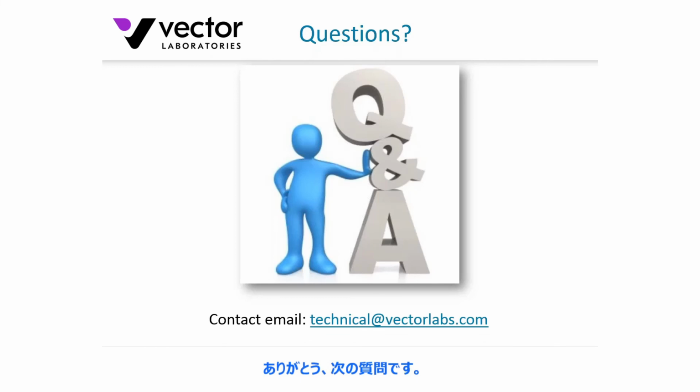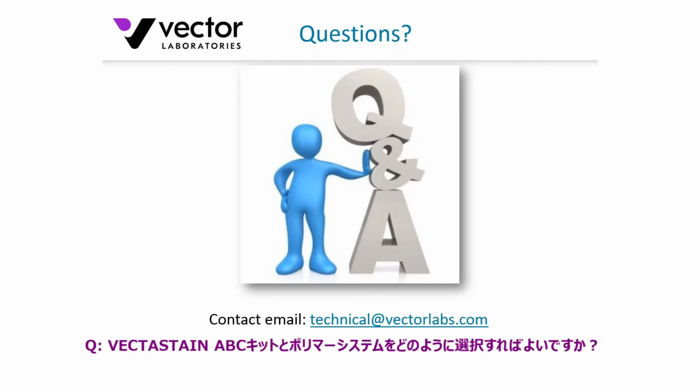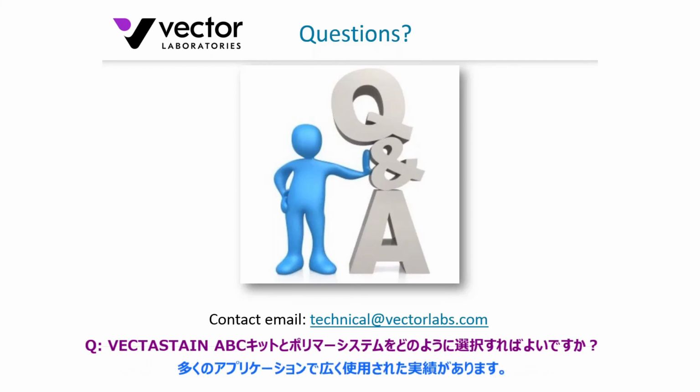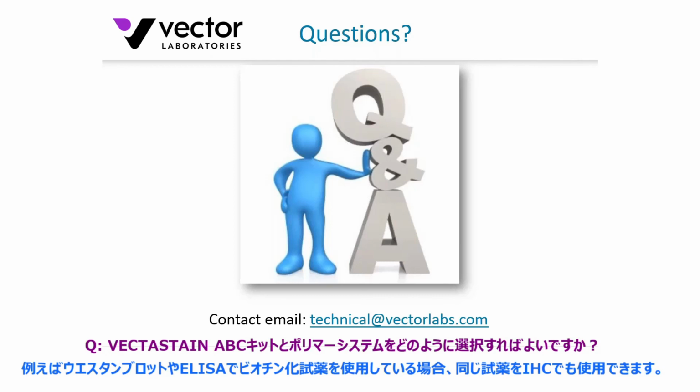Great, thank you, Craig. The next question: how should I select a VECTASTAIN ABC kit versus a polymer system? Yeah, these are parallel detection methodologies. The ABC system certainly has a track record of being widely used in many applications, whereby it exploits the high affinity of avidin and biotin. And as I mentioned earlier on, it's a very modular, flexible methodology, available in a lot of different formats, both streptavidin and avidin based. So indeed, it'll allow you to swap between methods.